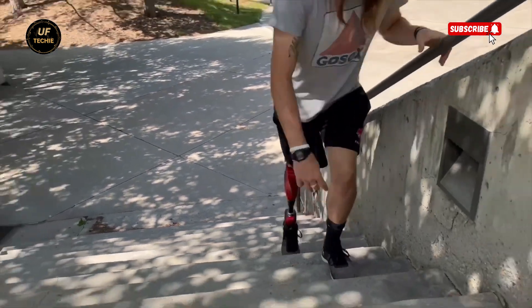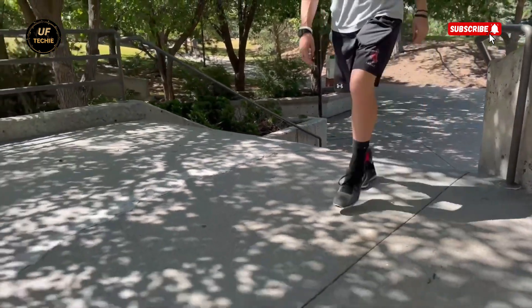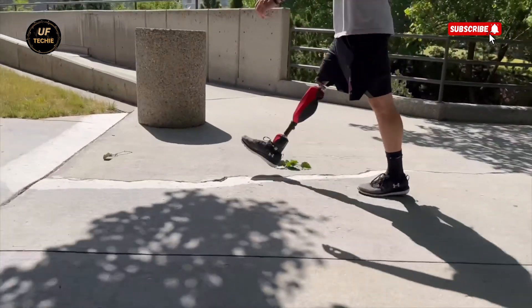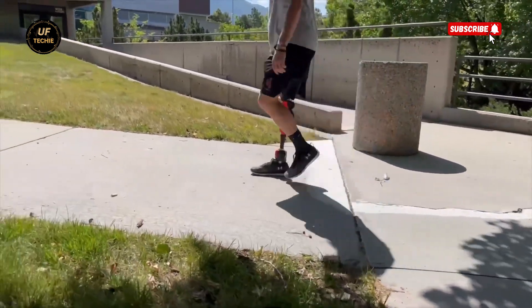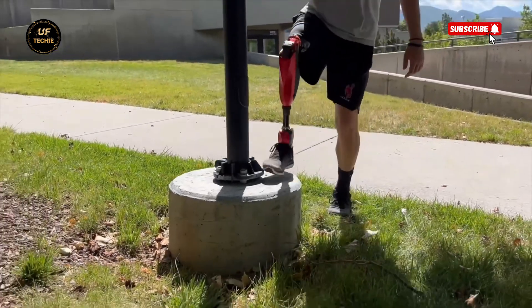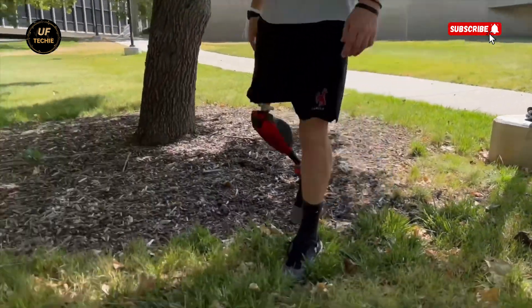One of the most impressive aspects is its active stair assistance. Climbing stairs is one of the most physically demanding tasks for amputees. The Bionic M leg provides extra motor-powered force to help ascend stairs more easily. On the way down, it offers controlled yielding that adjusts the descent speed, ensuring both safety and comfort.